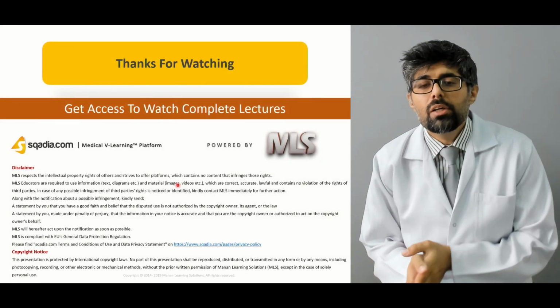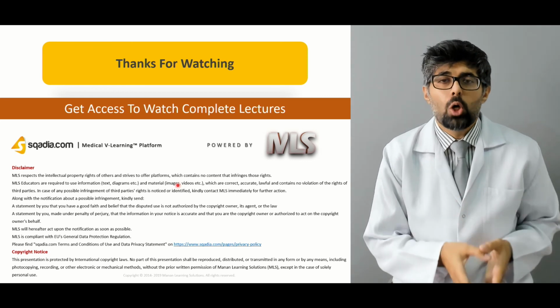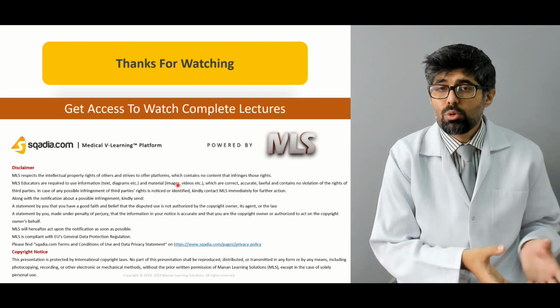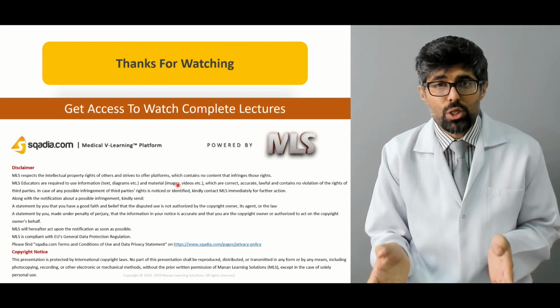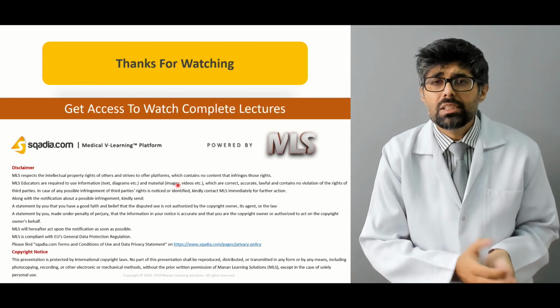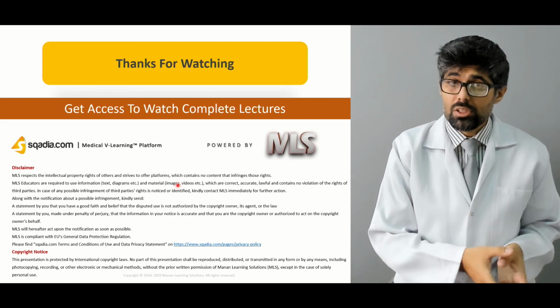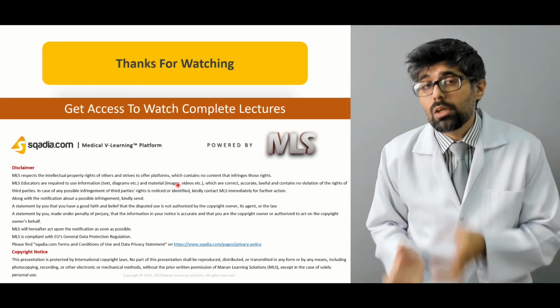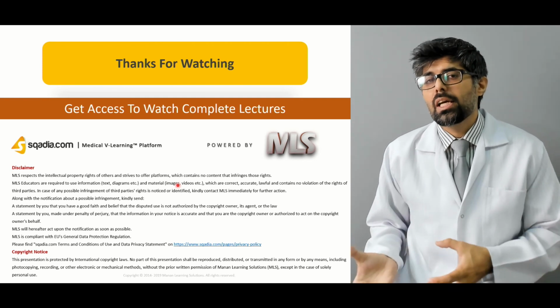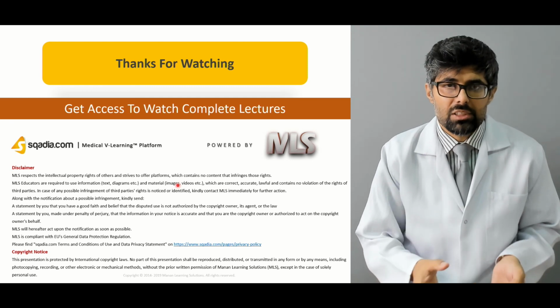So, what did we study in today's lecture? We studied abdominal imaging, what modalities to use, which modality to use in which situation, in what condition MRI is used, in which condition CT scan with contrast enhancement is used, in which particular condition ultrasound is used, even PET scan. We learned about the PET scan and its use in the staging of various cancers.